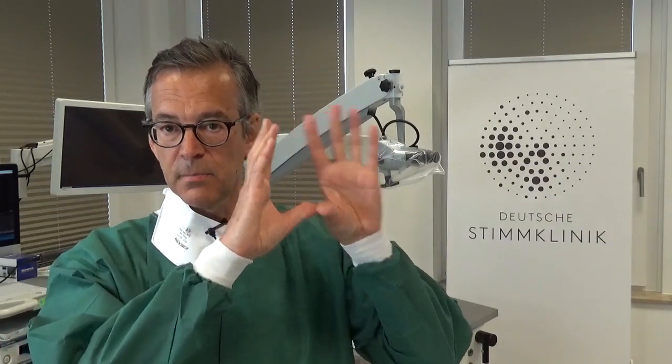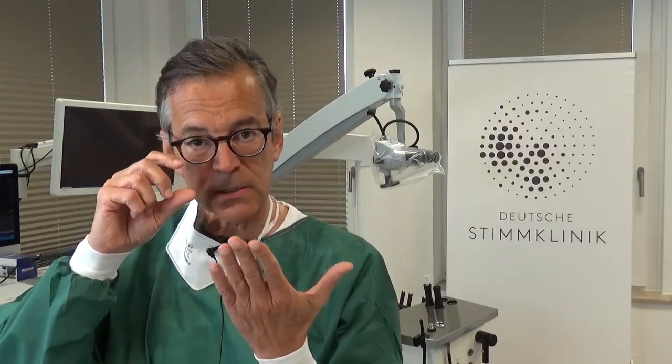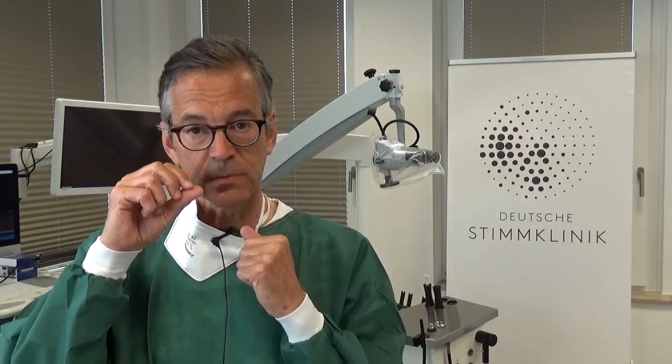Because of that, we want to take a lot of precautions so that even if something like that happens, we are not in danger. We will show you how we do that with our endoscope. With our endoscope type, we have a camera on the tip, which means we watch the monitor you can see over here. But we are also aware that some colleagues have endoscopes without a camera attached, which means they are even closer to the patient's face.